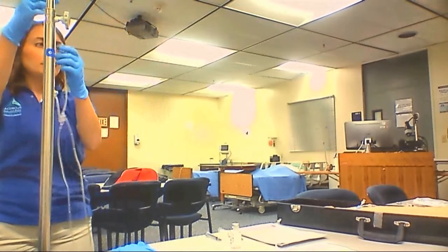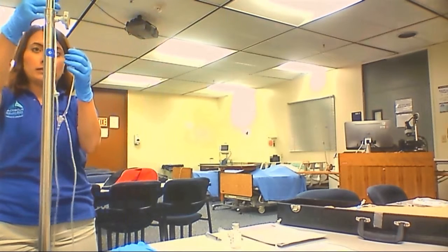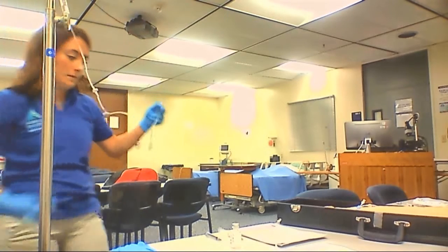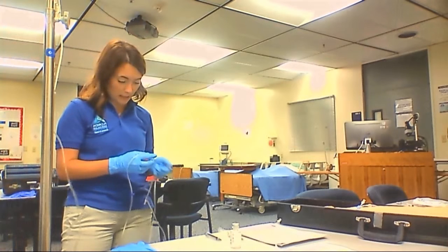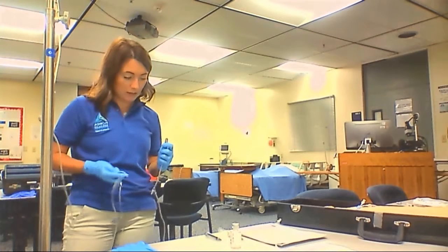Priming my tubing, about halfway full, making sure that fluid is going to flow through the tube, which it is. Clamping and unclamping. I have a free-flowing fluid, so that is what we want.